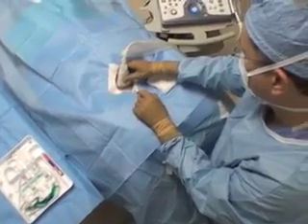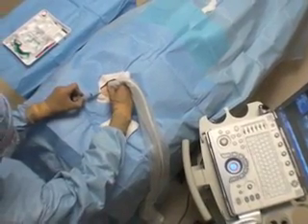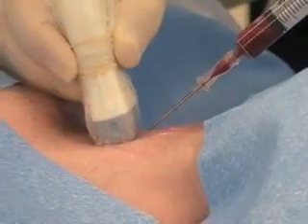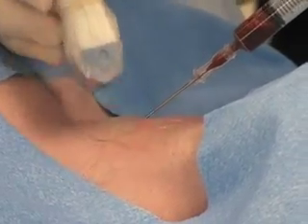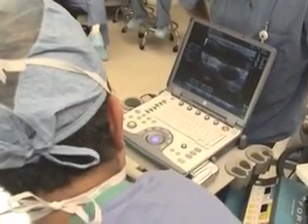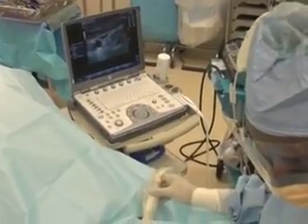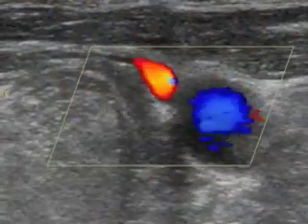Over the past decade, the increased use of ultrasound to guide internal jugular vein cannulation has improved success rates, reduced the time required to perform the procedure, and resulted in fewer complications. This technique requires an understanding of the neck anatomy as well as skill in performing and interpreting the results of the ultrasound examination. This video demonstrates the equipment and techniques used to carry out real-time ultrasound-guided internal jugular vein cannulation.